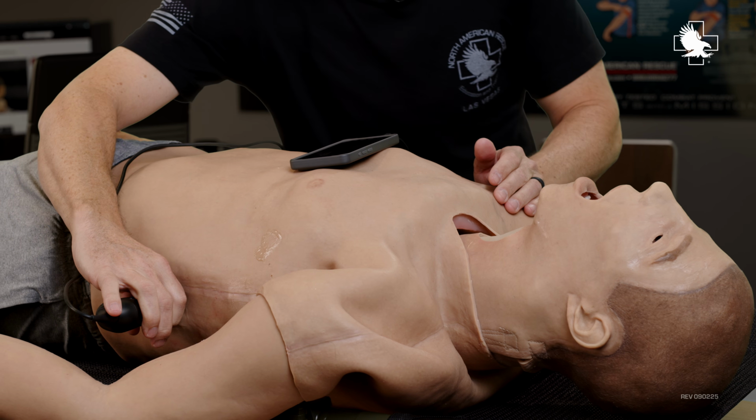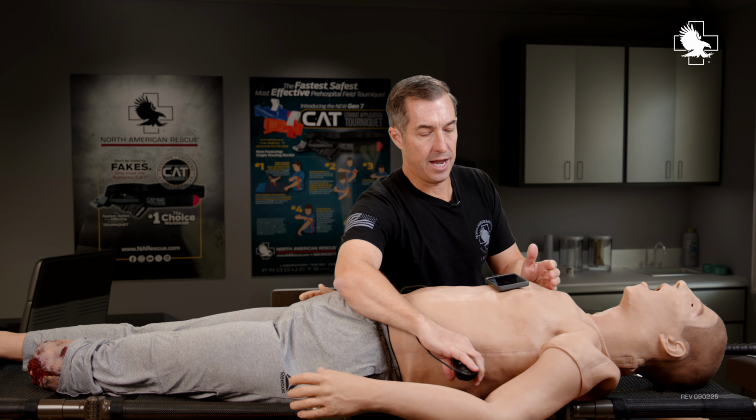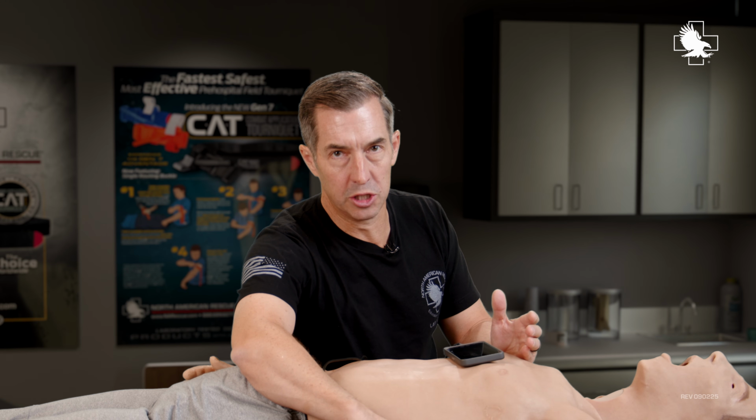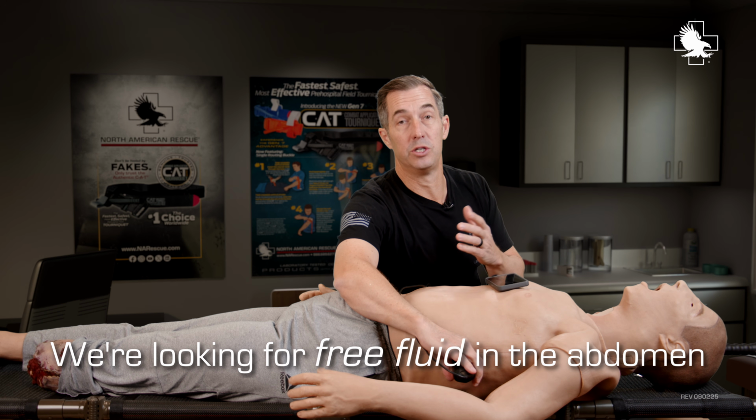Well, what am I looking for here? I'm looking for the spleen and the kidney where they intersect. Sometimes you can tell if it's a cracked or a fractured spleen, if there's a big hematoma within the spleen, but really we're looking for free fluid in the abdomen, which is going to be blood.